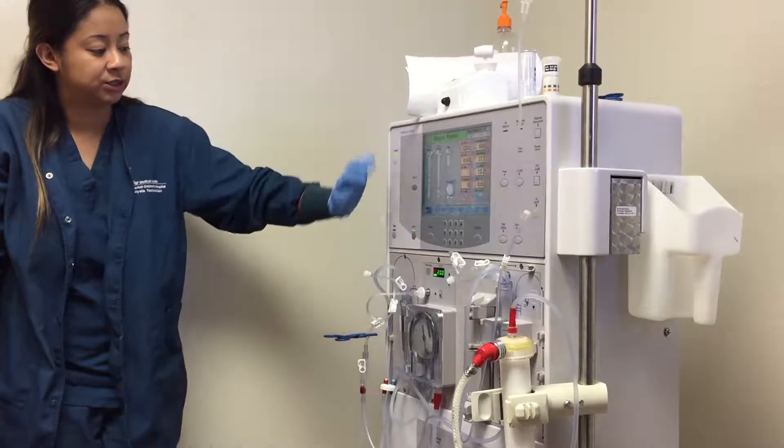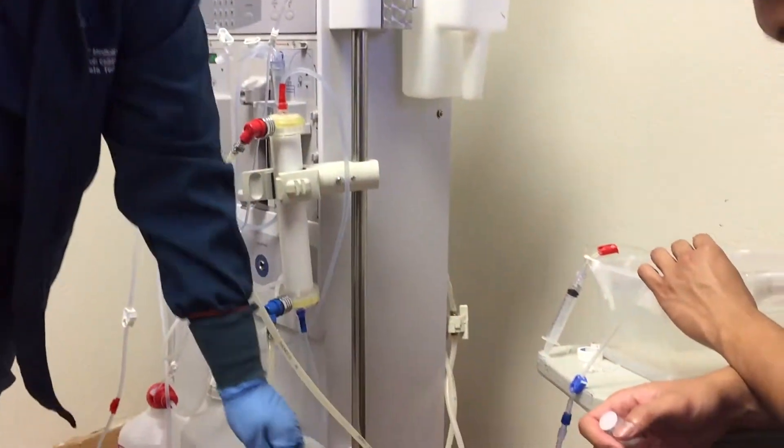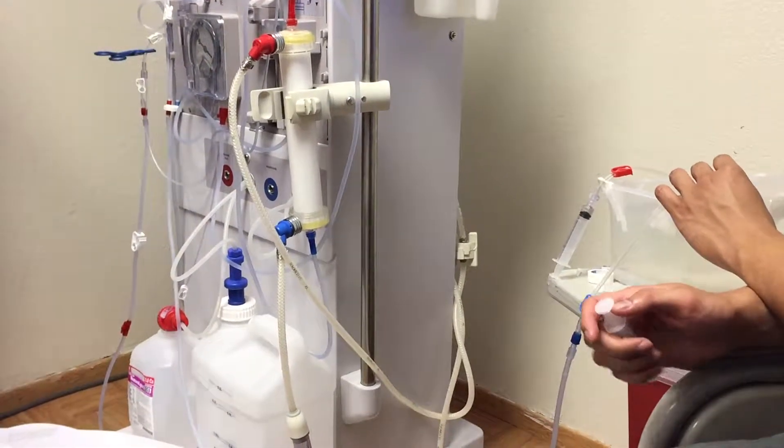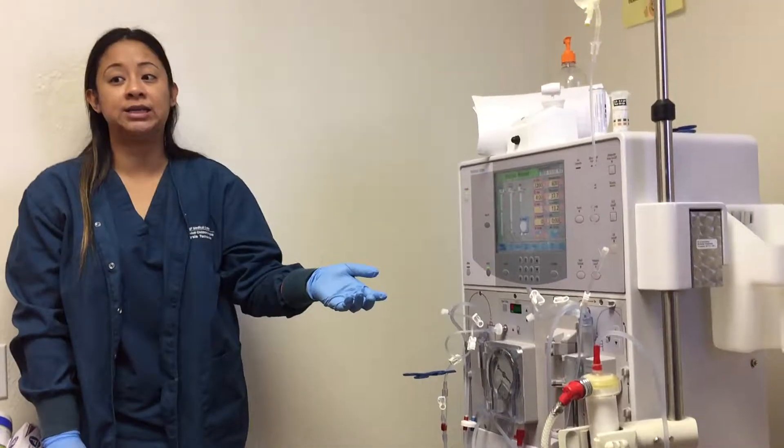And then once that's done, stop your blood pump and then disconnect your venous line. And that's when you can do your sitting blood pressure, standing blood pressure, and then you're going to remove your lines after.